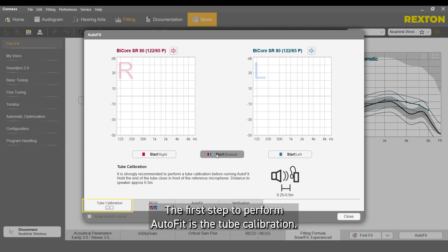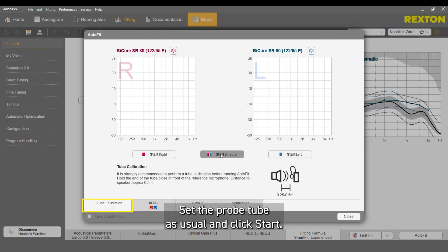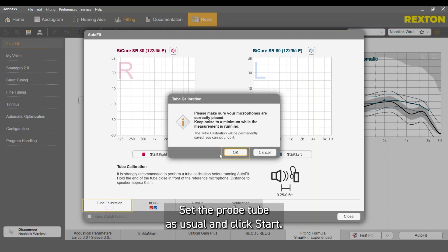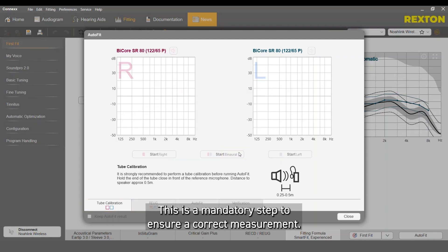The first step to perform AutoFit is the tube calibration. Set the probe tube as usual and click Start. This is a mandatory step to assure a correct measurement.